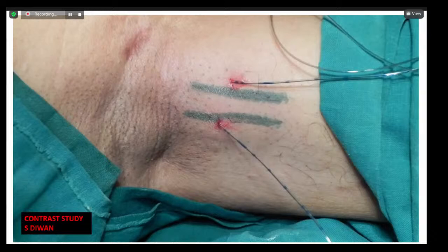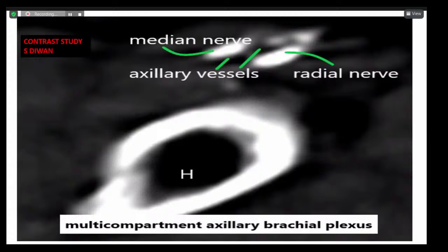We were not much aware at that point of time, because this is a potential infectious area. So we do not use any more axillary catheters. At that point of time, we used to use these catheters for almost 5 days. And in chronic pain, even 15 days with antibiotics and infusion pumps.